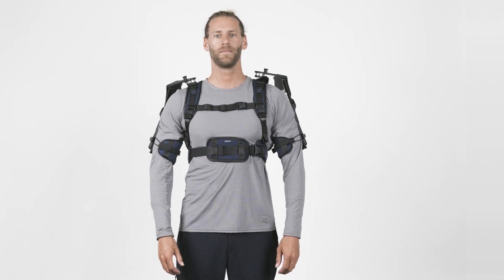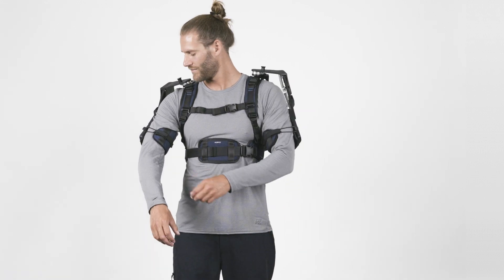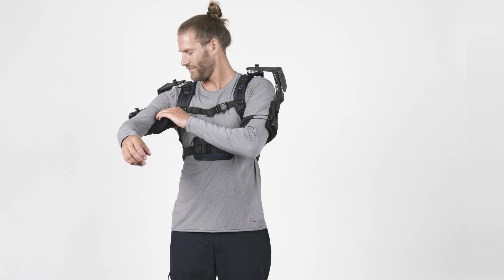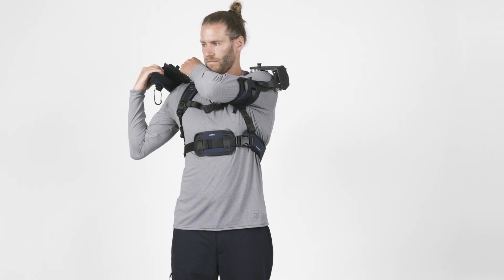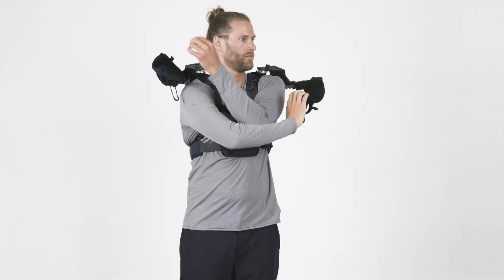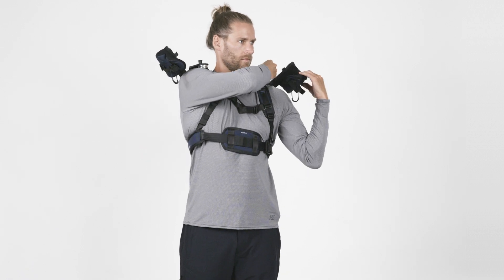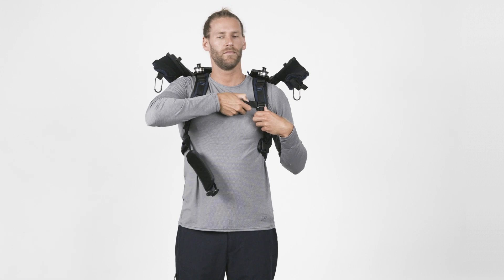When you have finished your work, the DeltaSuit can be removed easily. First, open the cuffs and take your arms out. Make sure you control the cuff movement while doing so. To avoid the cuffs from moving around during doffing, lock the shoulder joint. Repeat these steps for the other arm. When both arms are secured, open the two buckles in the front and remove the exoskeleton.